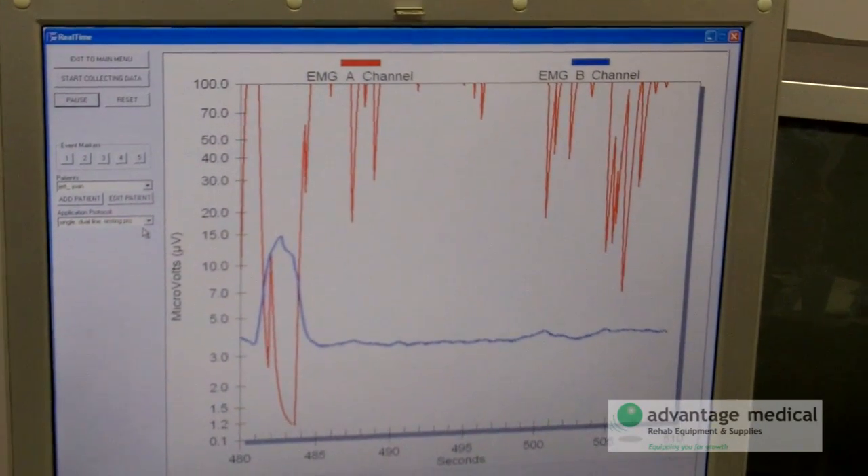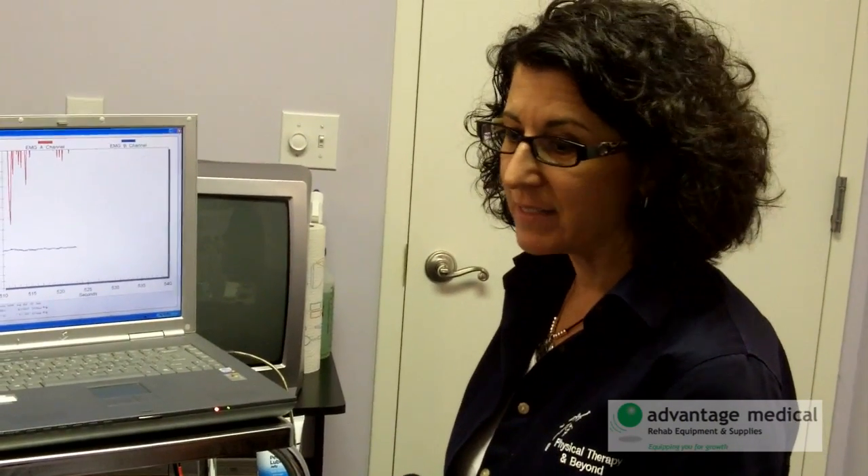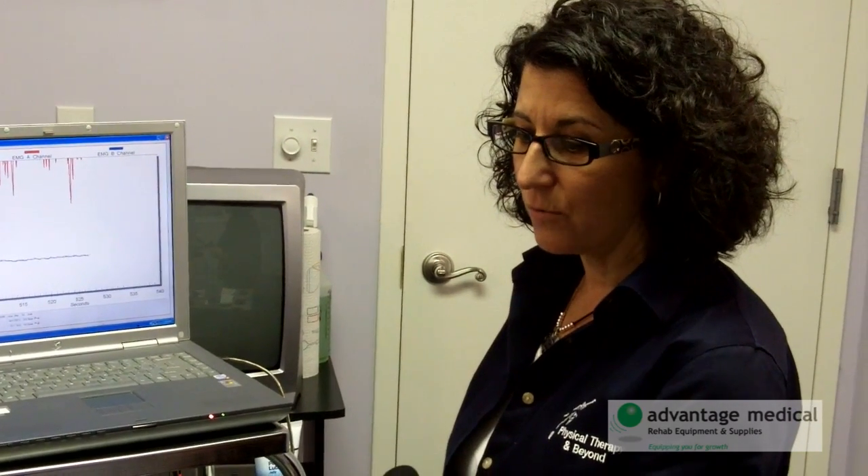So the first exercise we're going to start with are called Kegels. Because you're here for weakness, what we're going to do is focus on contracting and relaxing at the same rate. So we're going to have you do a five-second squeeze with the pelvic floor — no other muscles. I don't want you using your stomach, your inner thighs, or your buttocks. Just pelvic floor muscles. You're going to squeeze, hold for five seconds, and then release for five seconds.